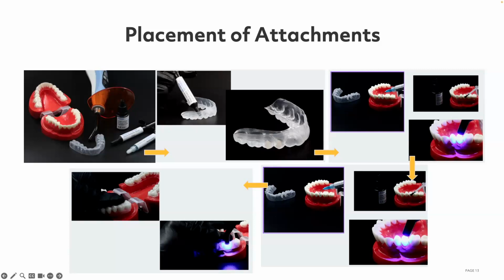You can pressure the occlusal part or even around the attachment if you feel like it fits better, but never touch the attachment because you're going to deform it. After everything is cured, you need to remove the template. When you are going to remove the template, open it a little bit, because it's flexible, to remove it more carefully. And after you remove it, you can place the light again to cure the rest of the attachment.